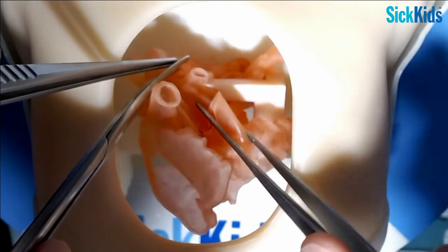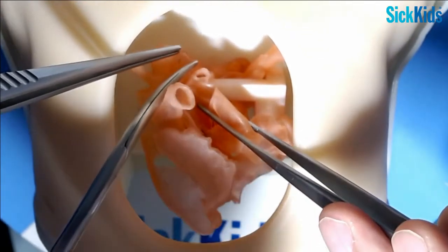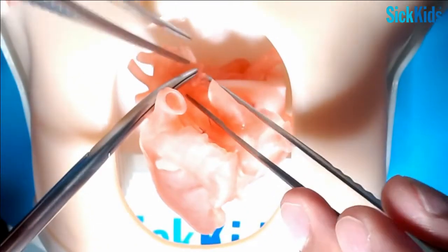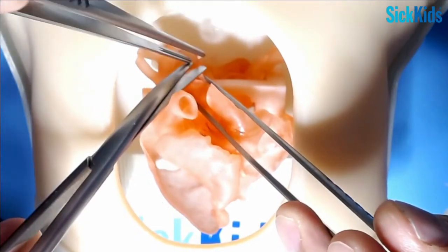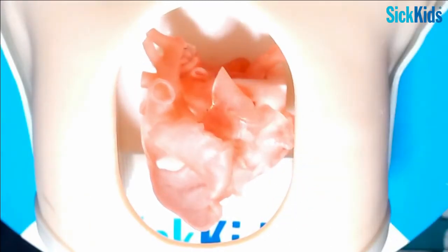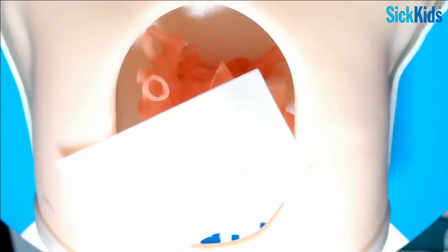You come to the anterolateral position here, and you want to go the diameter of the proximal descending aorta, or just more than diameter. And then I trim a little corner off each of these here, and then you're ready to start doing your patch. So let's talk about the patch. I do a build-it-as-you-go kind of patch.